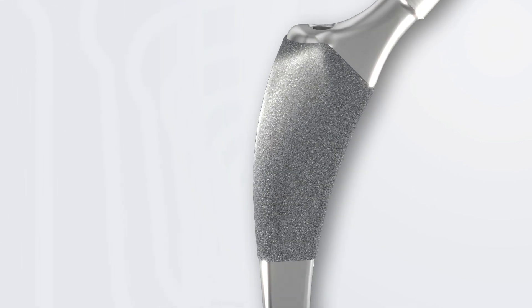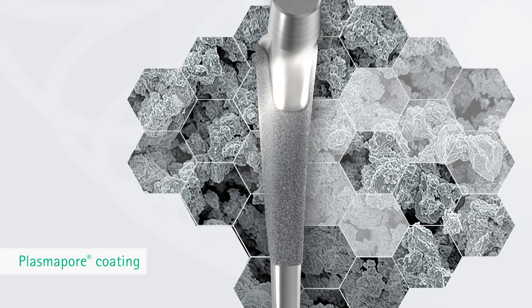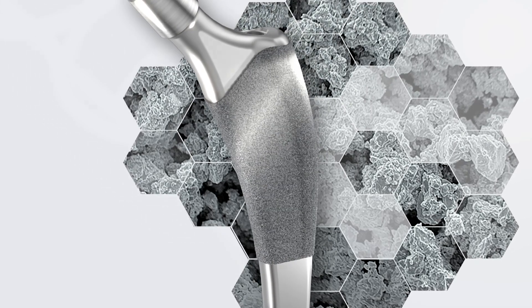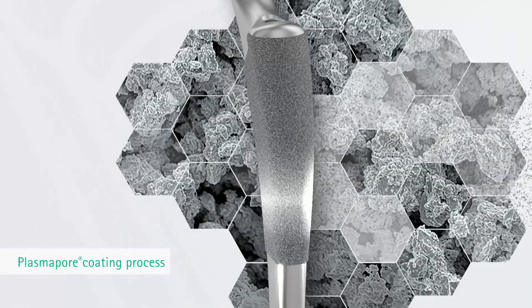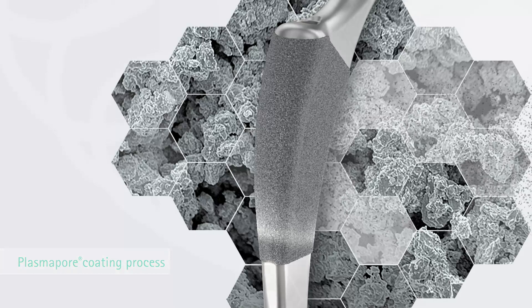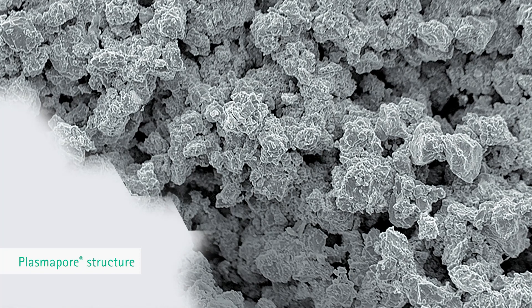For osseous integration into the proximal bone structure, the cementless Exia-T stem, which is made of Isotan-F titanium alloy, is coated with the proven microporous plasmapore titanium spray. During the plasmapore coating process, pure titanium powder with a thickness of 0.35 mm and a microporosity of up to 40% is sprayed on the proximal anchoring area of the implant. The very rough plasmapore structure also supports the implant's primary stability.